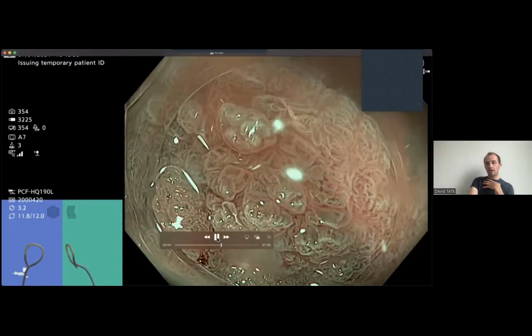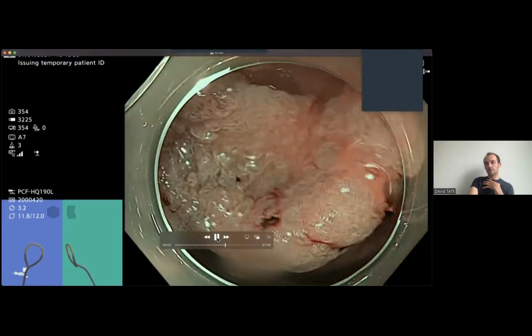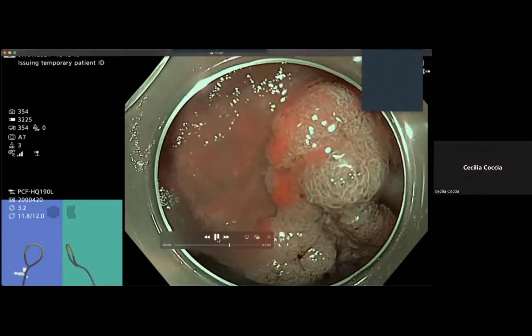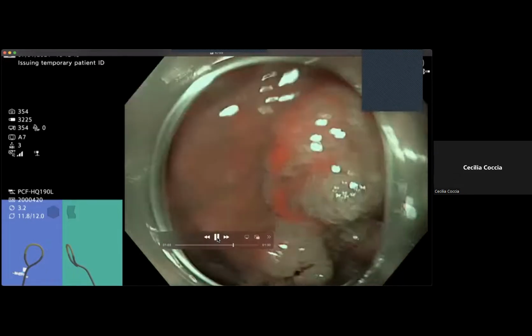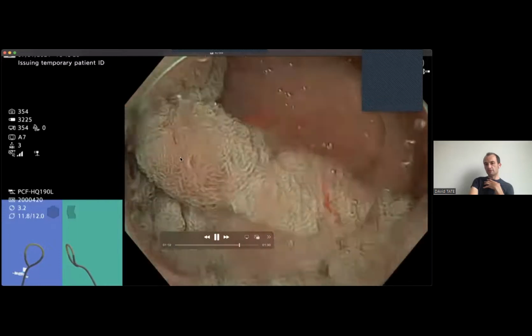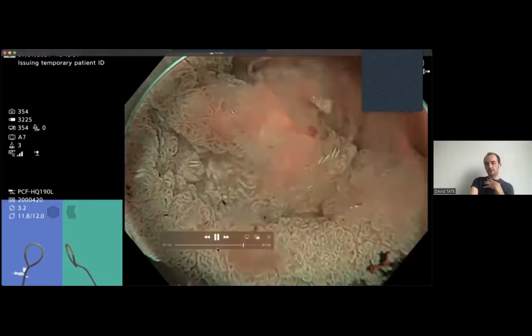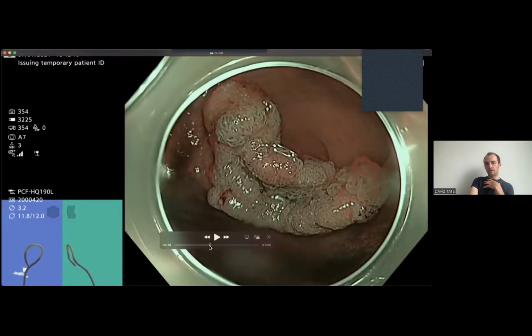We can see that. And the last one is the Paris classification. What do you think that is? Or if you don't know Paris, just describe it. I think it's an elevated lesion, so it's probably a 2A. Yeah, it's certainly 2A. And maybe there's a nodule here, do you think, at the top? Certainly not there, but at the top, there's just that little bit. Hold on a minute, let's see if we can find it again. See if in the distance you can see it there. On the left side, there's maybe a nodule. Do you agree with that?